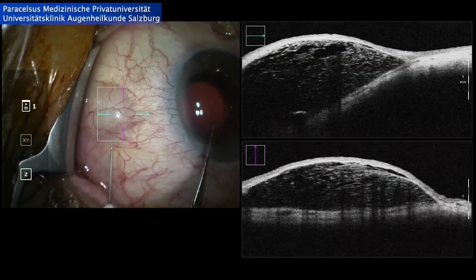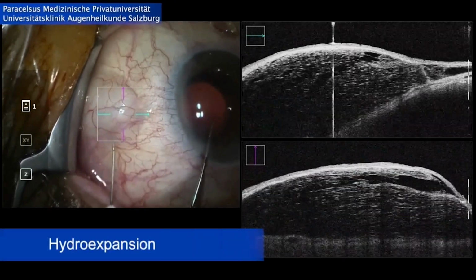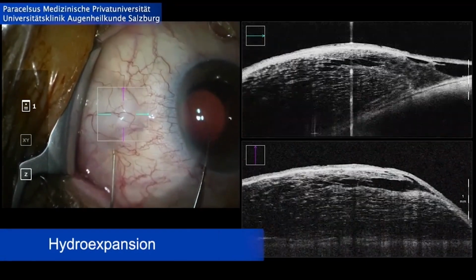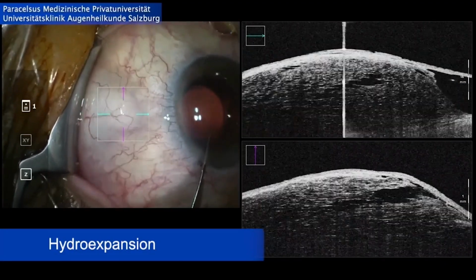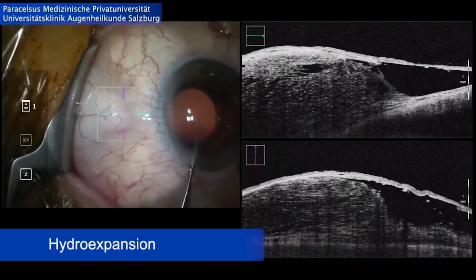And it's very interesting that there's actually no one plane that is being created. You can see the liquid just diffusing and hydrating the entire tissue and expanding all the Tenon's, which we can see with all these little irregular areas on the live OCT image.